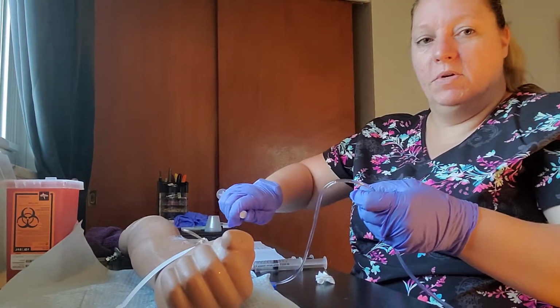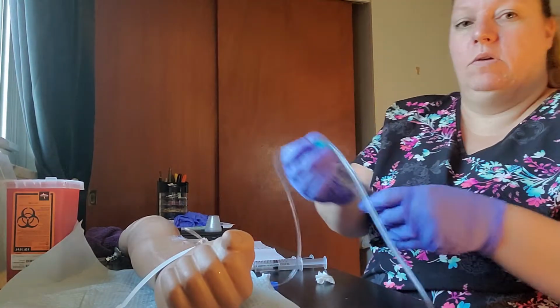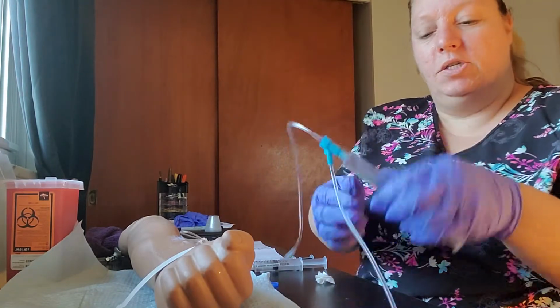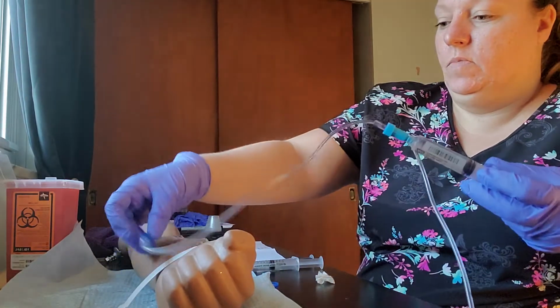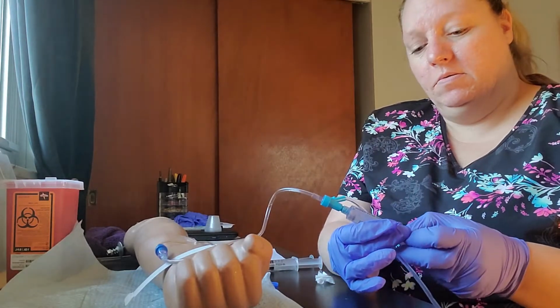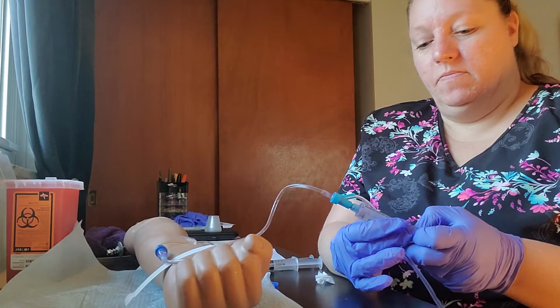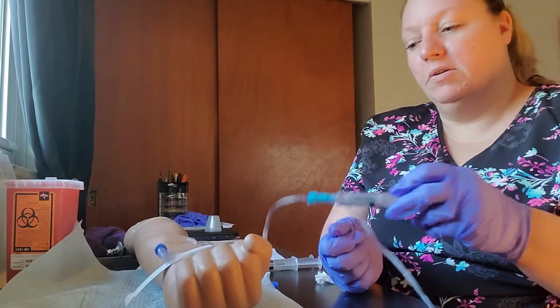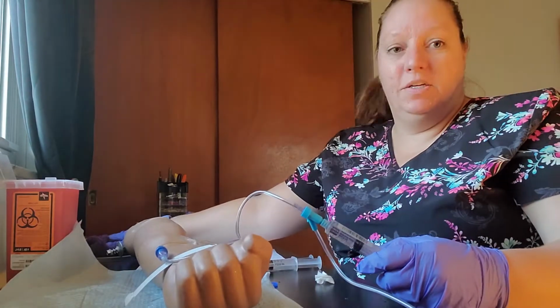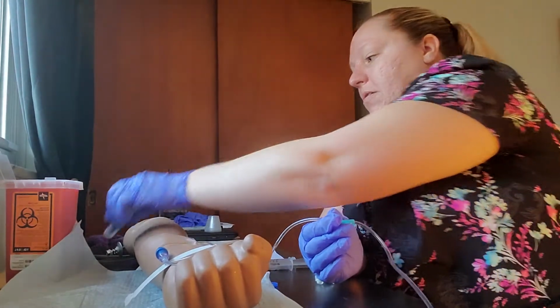We're going to take our normal saline flush. We're going to attach it. Here, let me put it this way so you can see. It's attached. And we're going to flush 3 milliliters. There we go. Do you see it going in? All right, it's flushed, 3 milliliters going in. This actually drains on the other side, so it's got tubing that it drains out of. So I've just got it covered down there. We'll take this off, throw this into our sharps container.